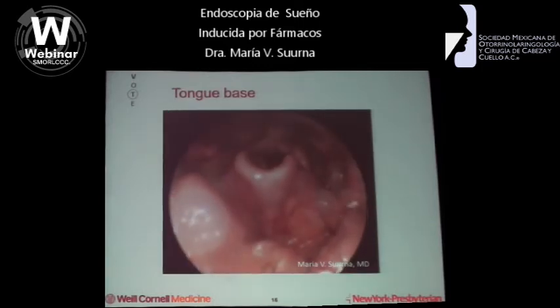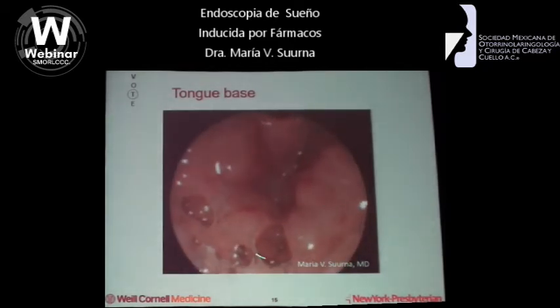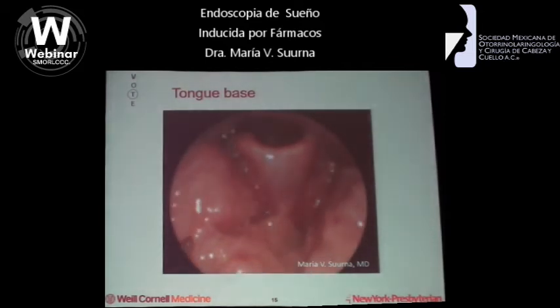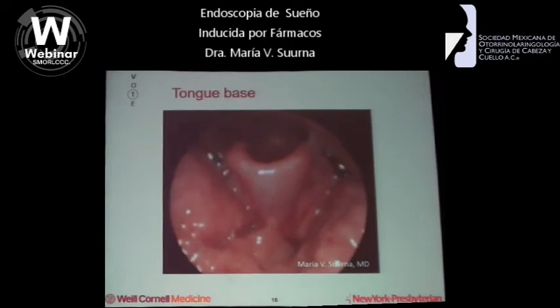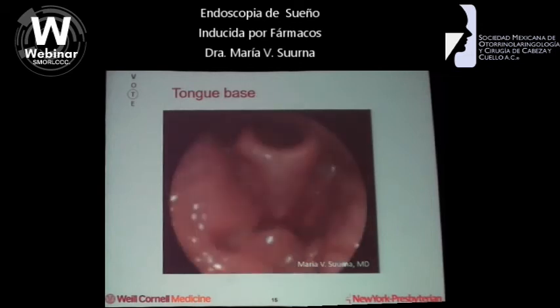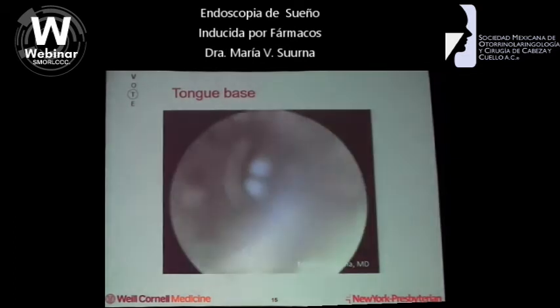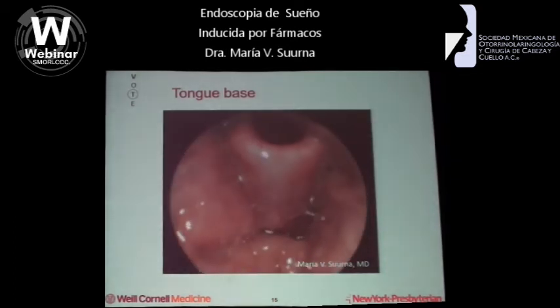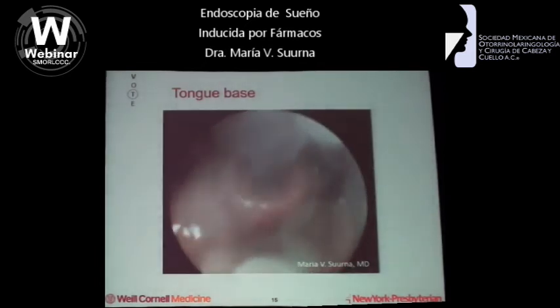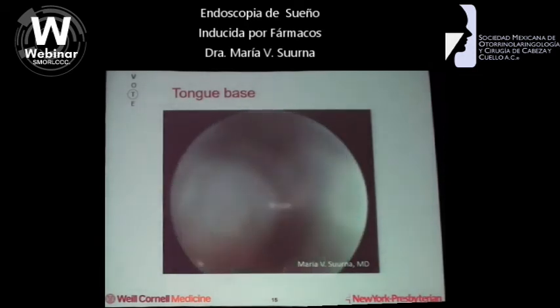And this is another video of lingual tonsils. So these are lingual tonsils, but they just have such a different appearance. And you can see how those lingual tonsils laterally squeeze the epiglottis and create significant airway obstruction. And mind you, this patient actually had palatal tonsils removed before, and he still has all of this tonsillar tissue. And what I find sometimes when you tell patients that they have lingual tonsils and the lingual tonsils are contributing to their airway obstruction, their first comment is, but I already have my tonsils out. And you're like, well, there's different kinds of tonsils too. So anyway.